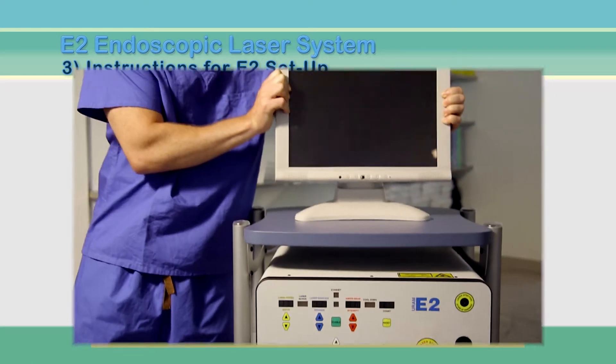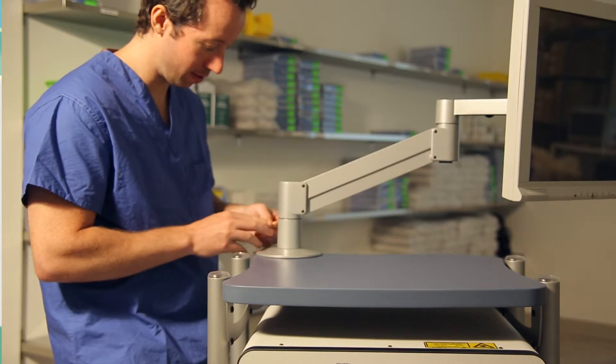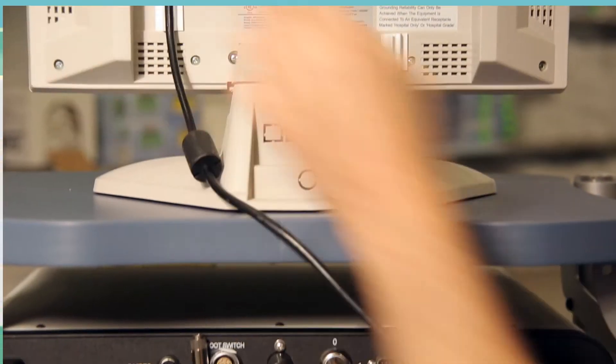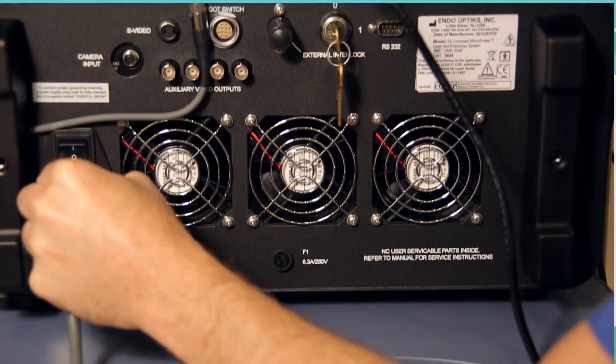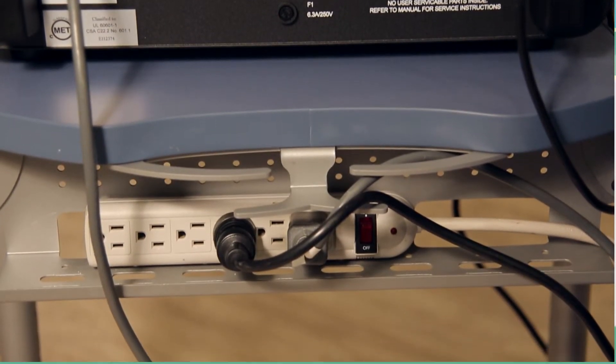Place the E2 console on the lower shelf and the monitor on the top shelf or attached to the flexible arm. There are two power connections required: one for the monitor and one for the E2 console. These are typically plugged into a power strip that can be fixed to the base of the cart with an extension to the wall outlet.